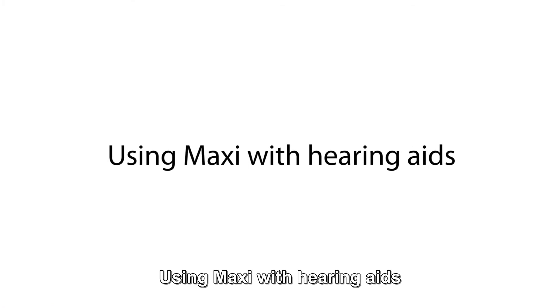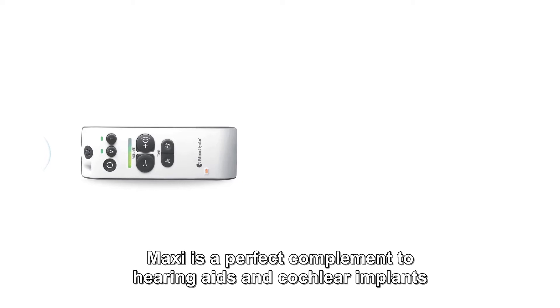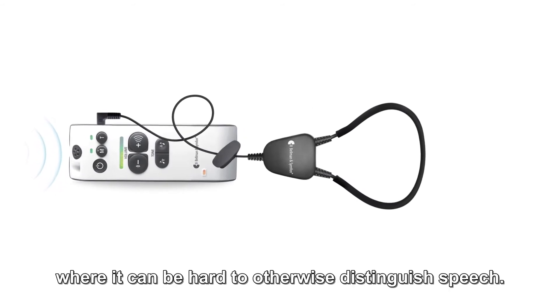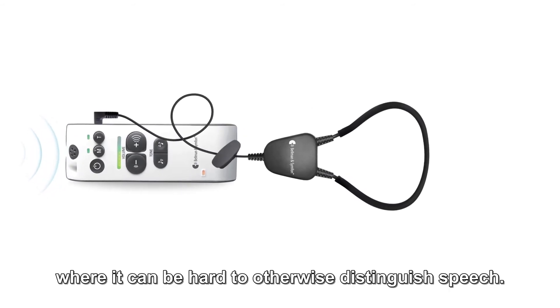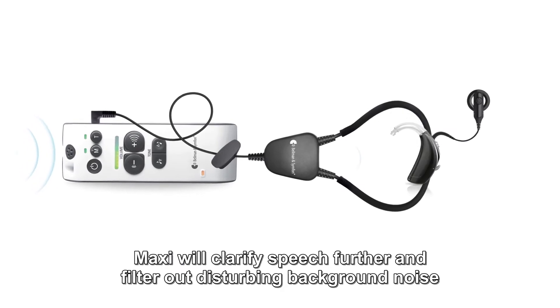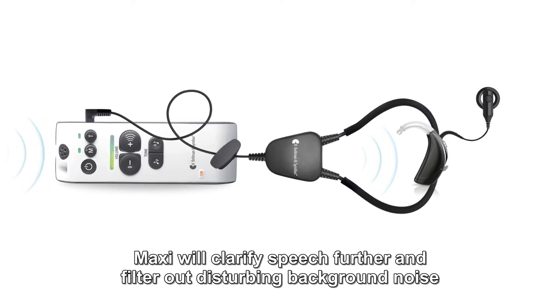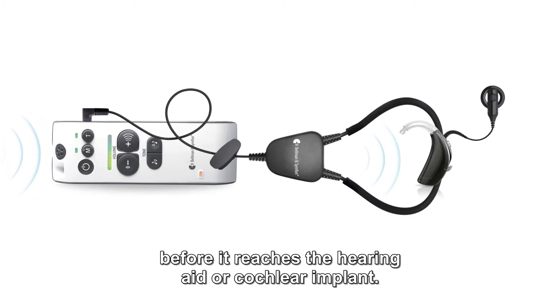Using Maxi with hearing aids. Maxi is a perfect complement to hearing aids and cochlear implants in situations with a lot of background noise, where it can be hard to otherwise distinguish speech. Maxi will clarify speech further and filter out disturbing background noise before it reaches the hearing aid or cochlear implant.